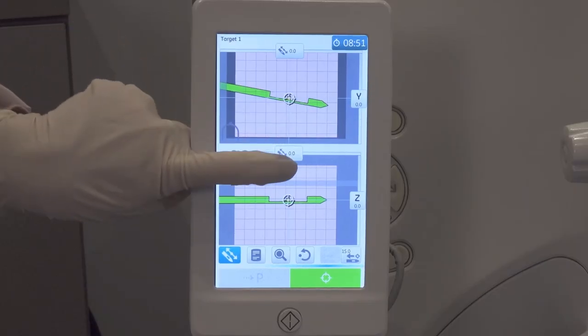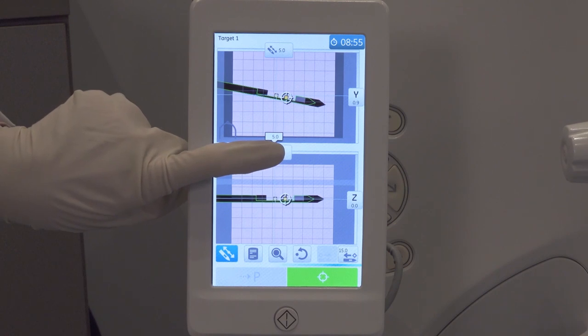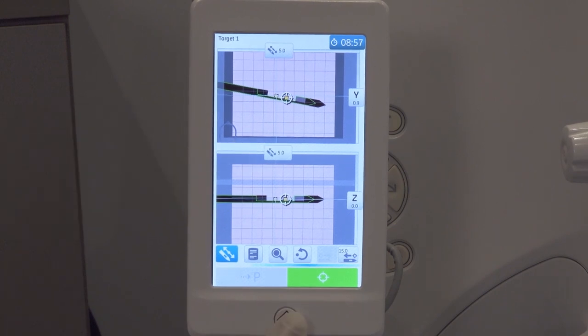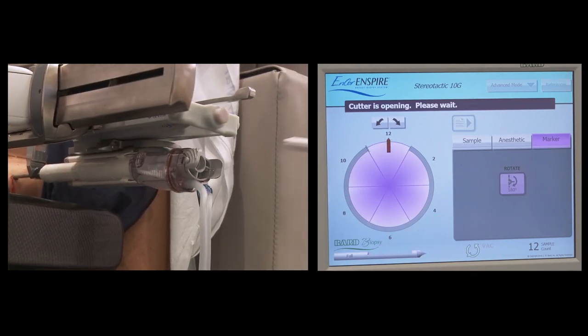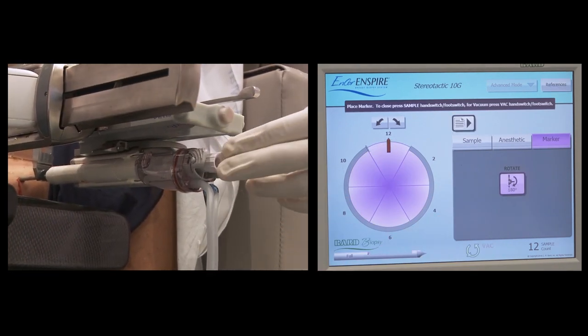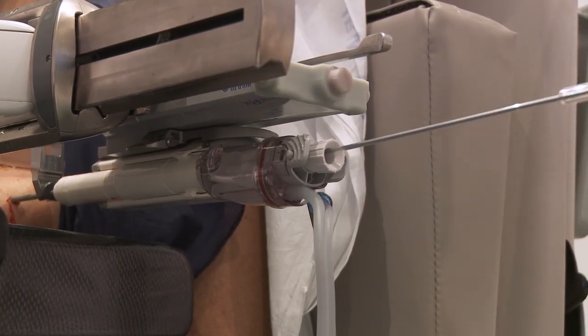The use of a tissue marker is strongly recommended since the lesion is not visible in conventional imaging. The marker is deployed in the biopsy coordinates, shifted by 5 mm. Select the marker tab, replace the basket rear cover with the marker adapter and introduce the marker applicator through the probe internal sheath.